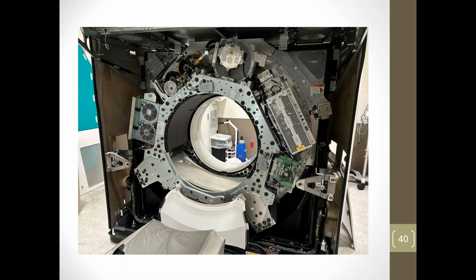So the big bores are actually so they can utilize this big detector, and they can get a bigger slice of the patient, and they can get bigger angles of them. So just a little tidbit: when you hear about big bore, it's not a bariatric issue; it's a procedural technique issue that they have the bigger bores for.